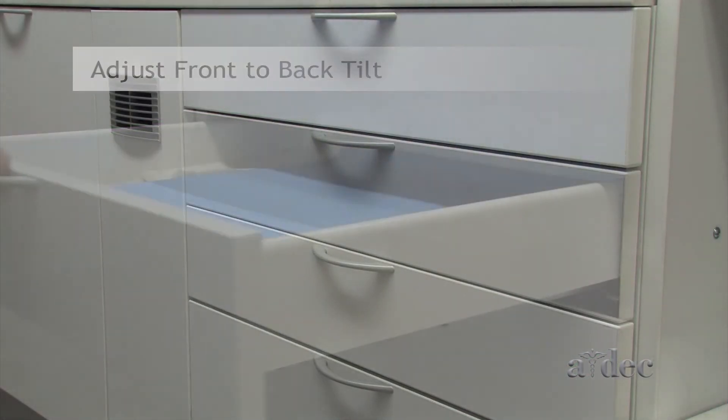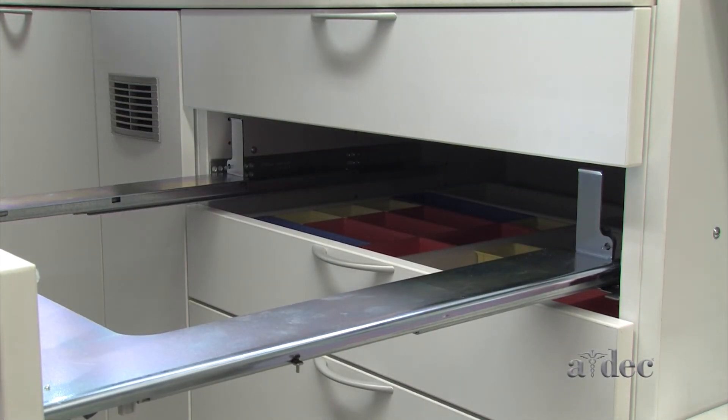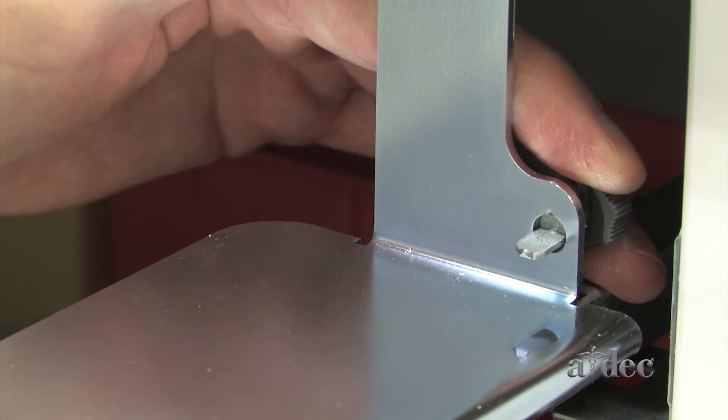To adjust the drawer face front to back, remove the tub insert. Rotate the dark gray tab to tilt the top of the drawer face toward the cabinet.